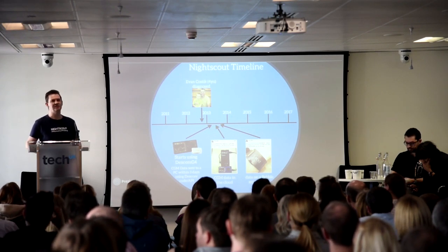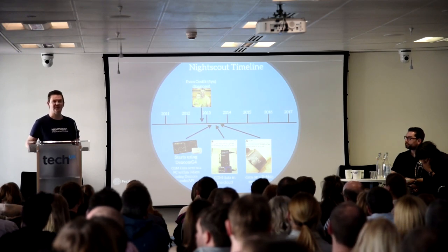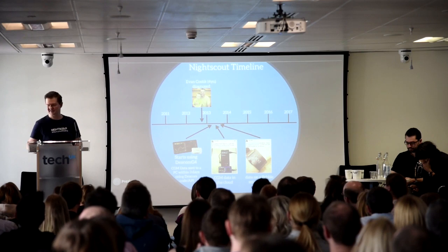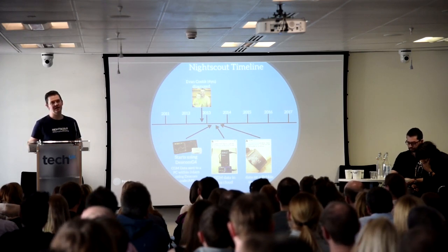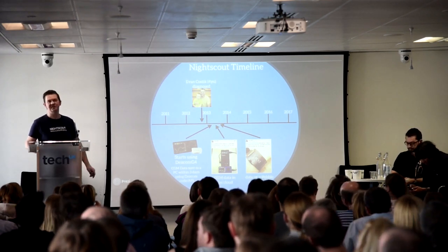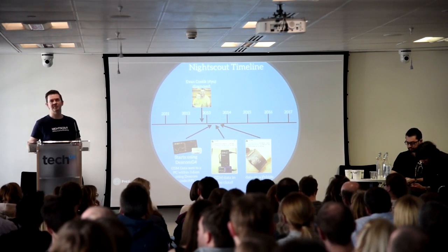I'll get some data out of this if I write a program on my PC, which he did within 3 days, which, as a programmer myself, I think even defining what I want to do in 3 days is quite amazing. Within a few months, straight after that, he wrote the same sort of program on an Android phone. As you can see in the middle there, it's plugged into a Dexcom receiver. From that point, data could get to the internet. Data was uploadable to the internet.